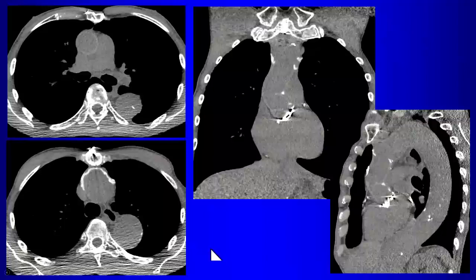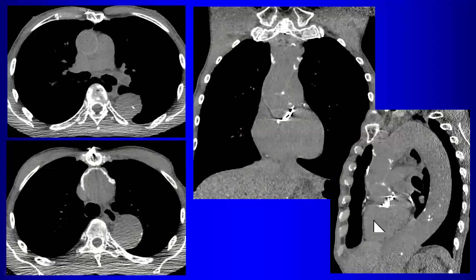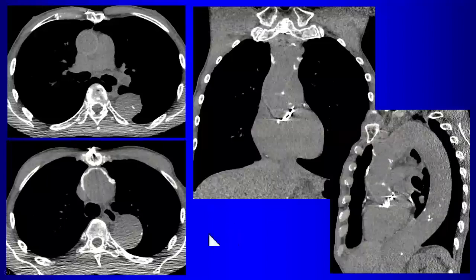Postoperatively, it is essential to include non-contrast images when evaluating the aorta after surgery, because the graft material appears as a rim of high attenuation on non-contrast CT. This allows differentiation from abnormal contrast collections. The prosthetic valve, graft, suture material, pledges, and other surgical material are all visible on non-contrast CT. You don't want to confuse surgical material with extravasation of contrast on post-contrast images.